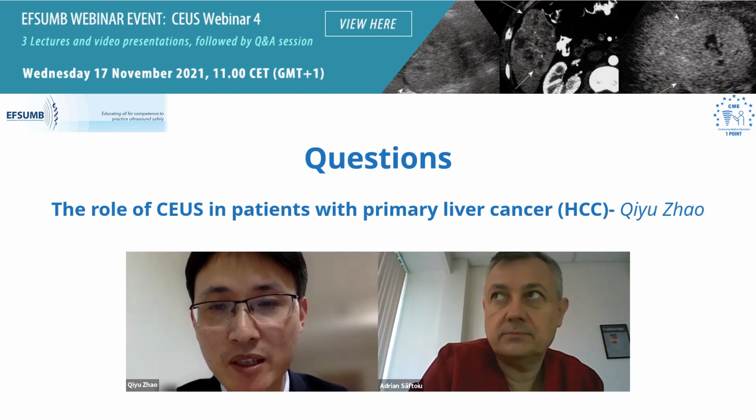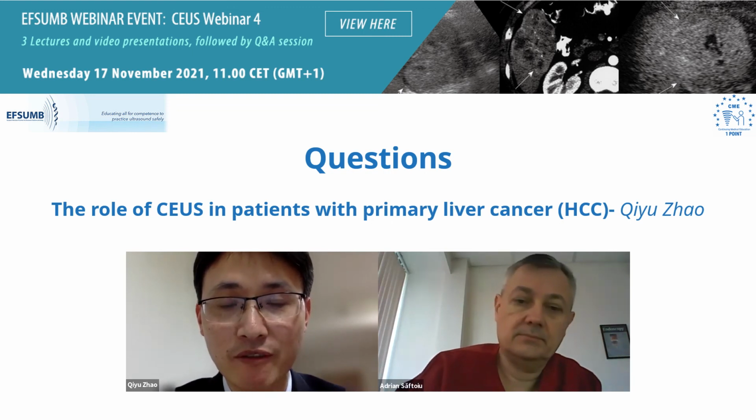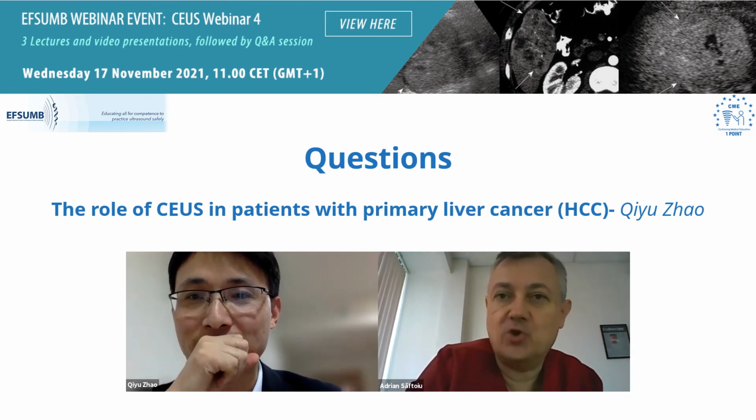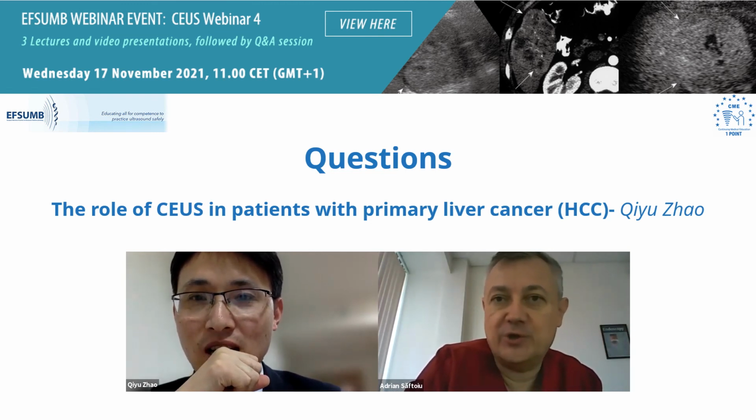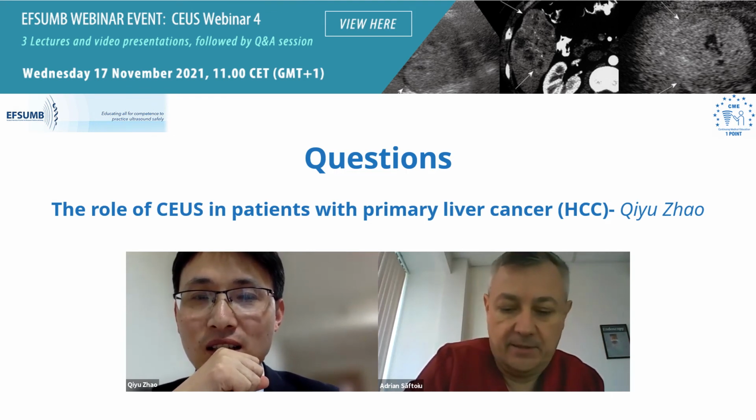Sonazoid may be helpful in the case of well-differentiated HCC, because with SonoVue some cases show no washout, while with Sonazoid, maybe in some cases we can find the washout. Okay. We don't have experience in Europe, because except Norway, where Sonazoid is approved, Sonazoid is not approved in Europe, so we only have experience with SonoVue. We cannot get it for examination purposes.